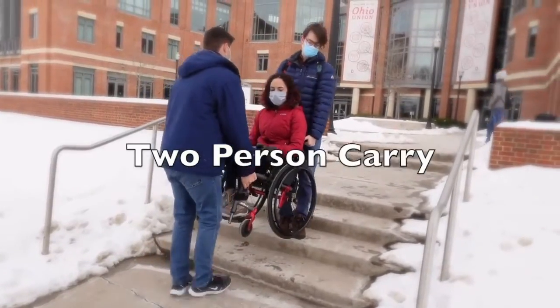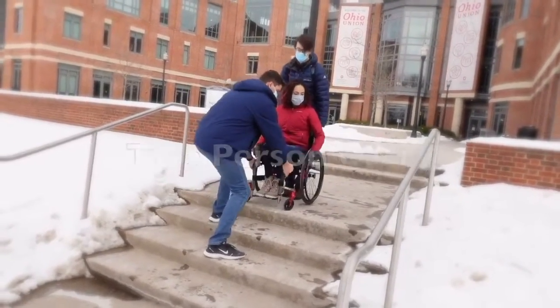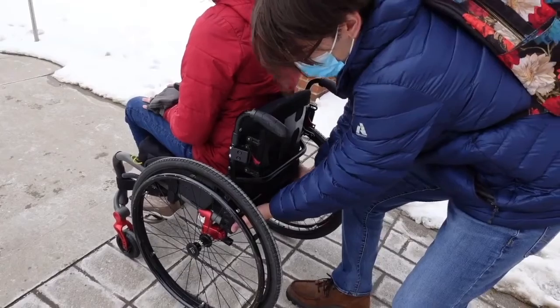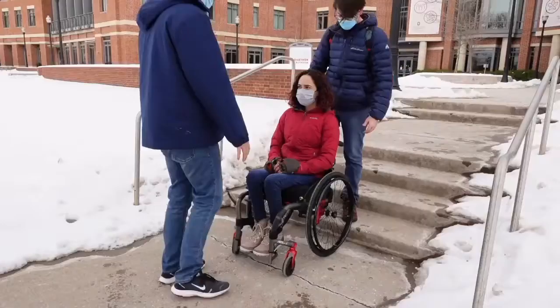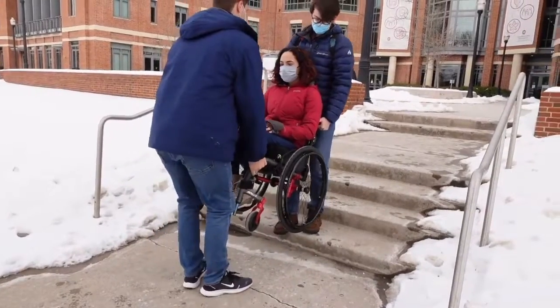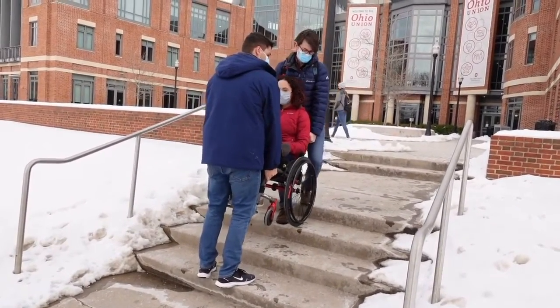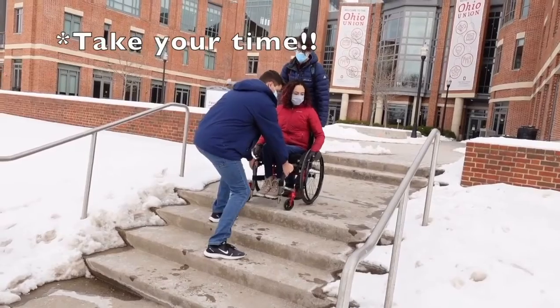A two-person carry is best used when you have two strong and capable people and you need to get your wheelchair over some sort of rough terrain. So the first person in the front needs to grab the chair by the frame, and the second person in the back needs to grab either by the push handles or underneath on the actual frame of the chair. Grabbing something other than the frame of the chair could cause part of the chair to come loose and thus endanger the person in the wheelchair. After positioning their hands correctly, the two people lifting the chair should count down and make sure that they lift at the same time and continue to move in sync while they are holding the chair to ensure that everything moves swiftly and safely.